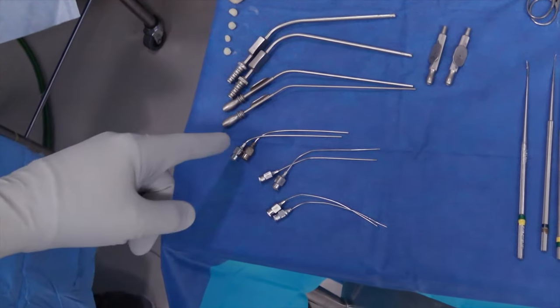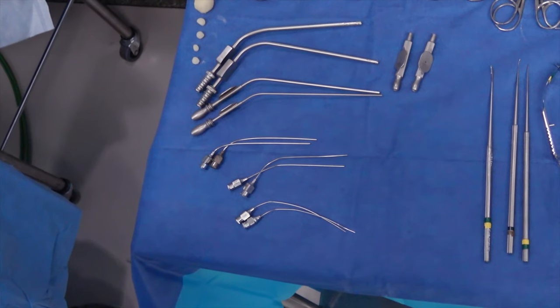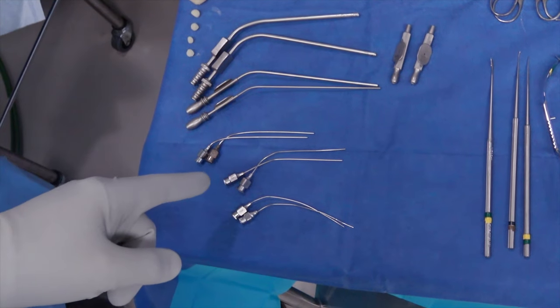Then we have our micro-instruments. All of these have a fenestration or a teardrop tip that you can release or add suction by taking your thumb on or off the hole. We have three different sizes we'll typically use for micro-suctions: an 18, a 20, and a 22.